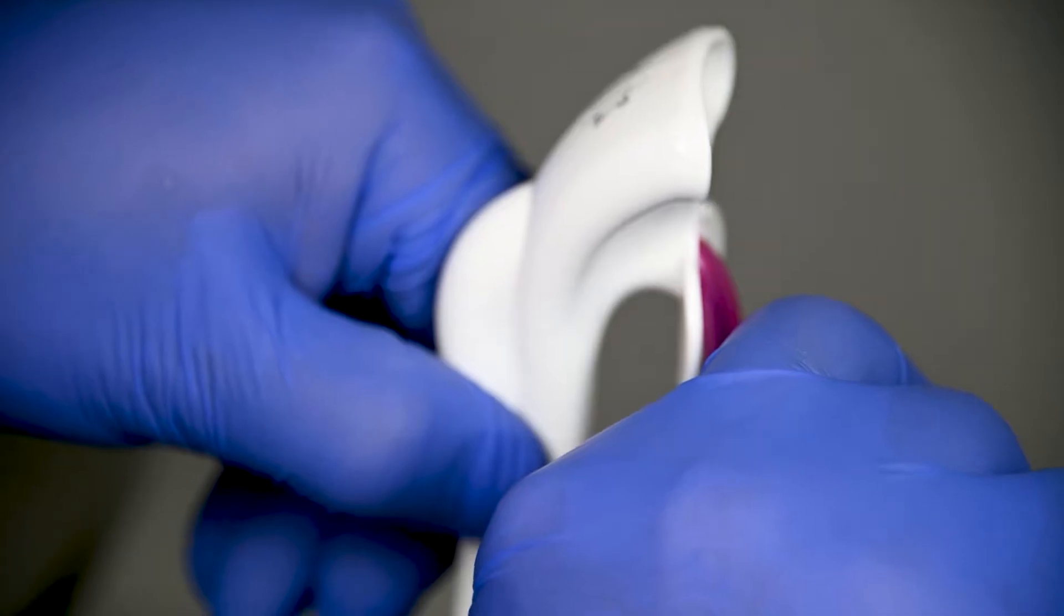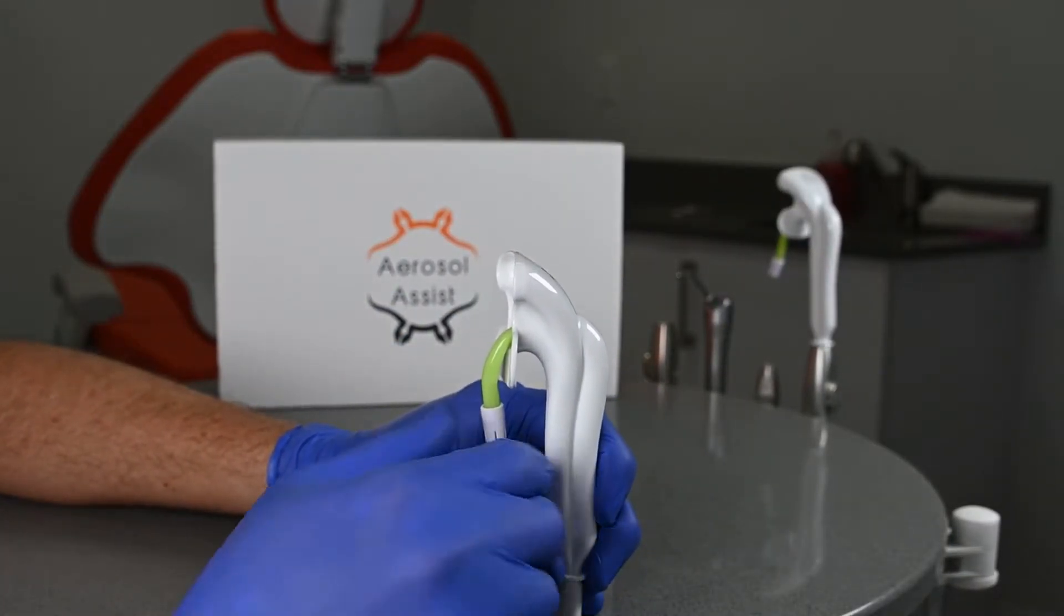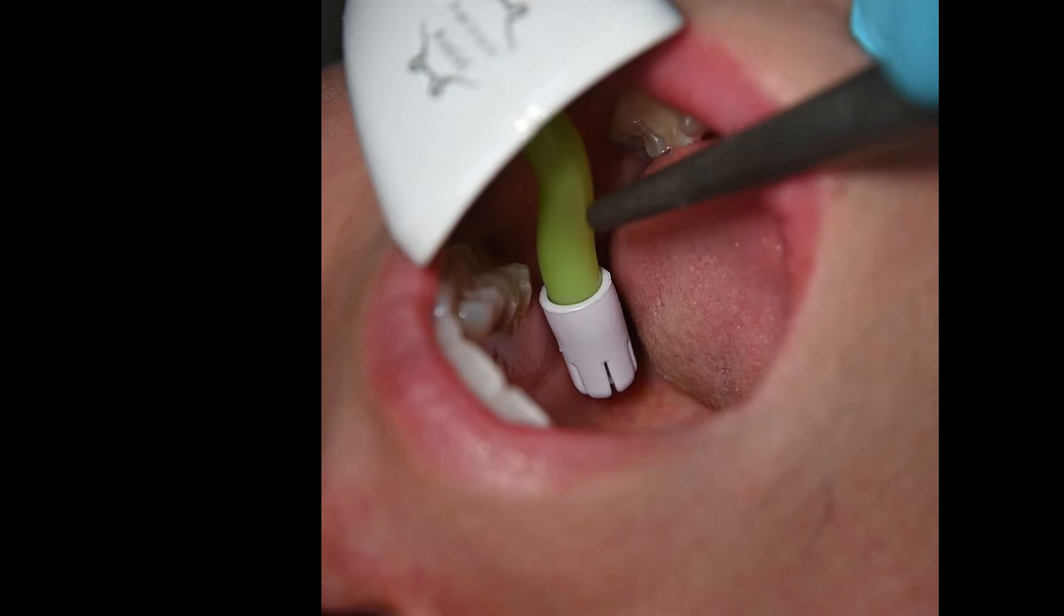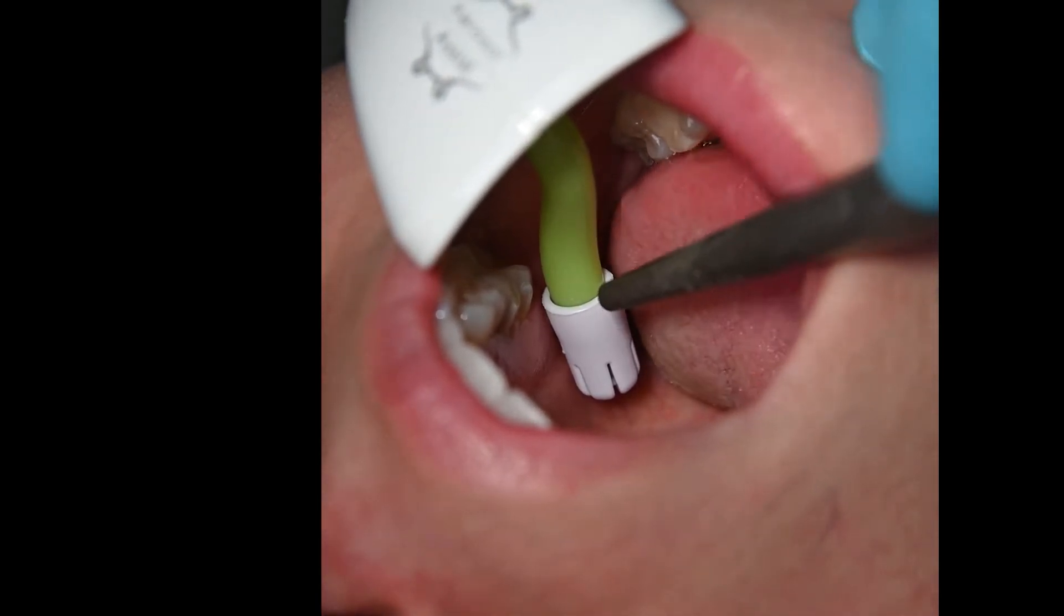You can now change the position of the saliva ejector to fit in the most comfortable position for the patient. This starting position will work on most patients and is able to avoid gag reflexes by not touching any gums, teeth, or other anatomical landmarks.